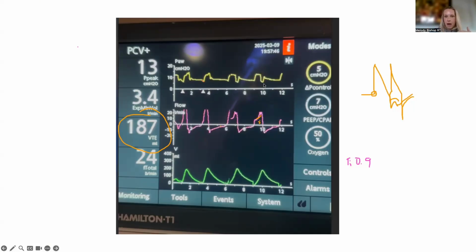And once we get there, then absolutely what you mentioned about dropping the rate in a control mode is a great option. Sometimes I'll bring everyone to the bedside, because usually the argument is that it's a double trigger, and I'll say a double trigger is where the first breath is patient triggered. But reverse trigger, by definition, the first breath is machine triggered. So I show them there's two breaths here.